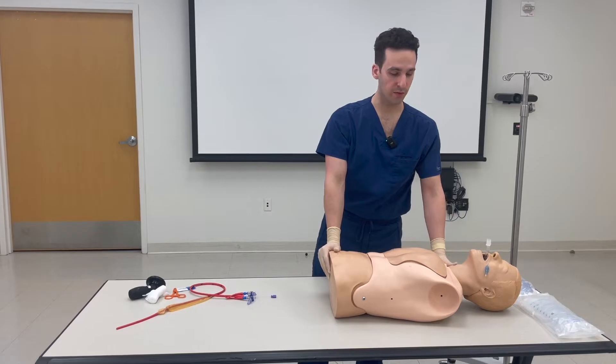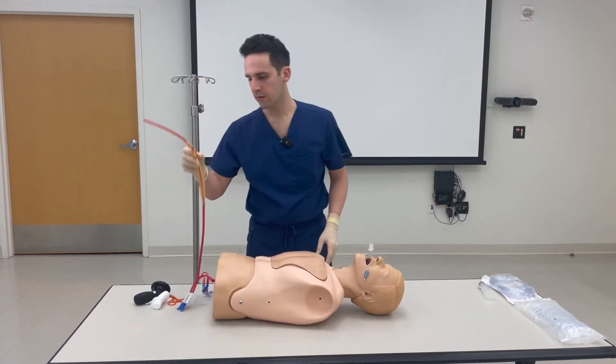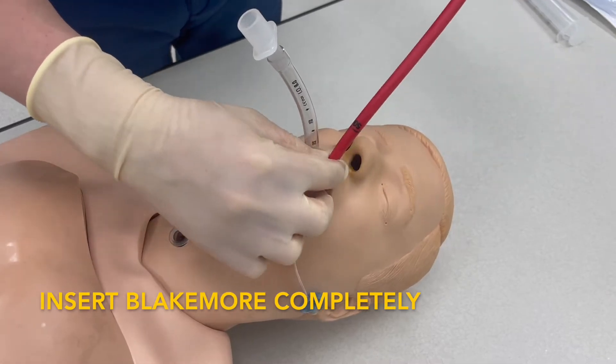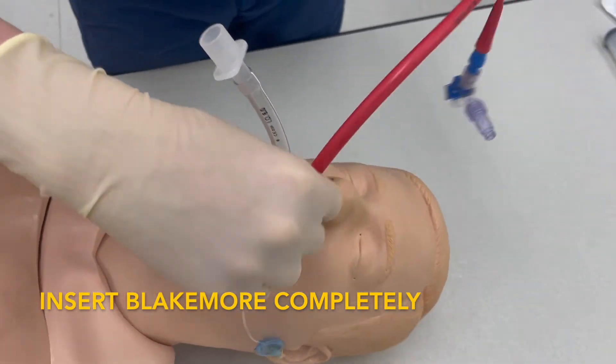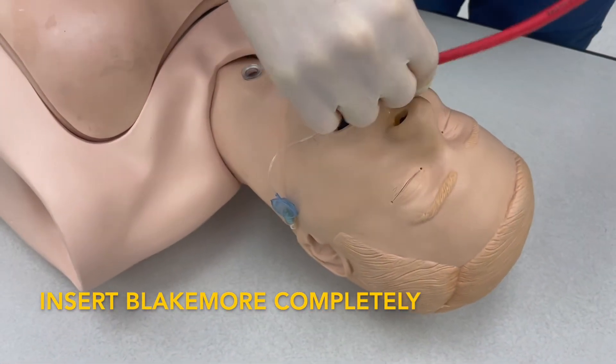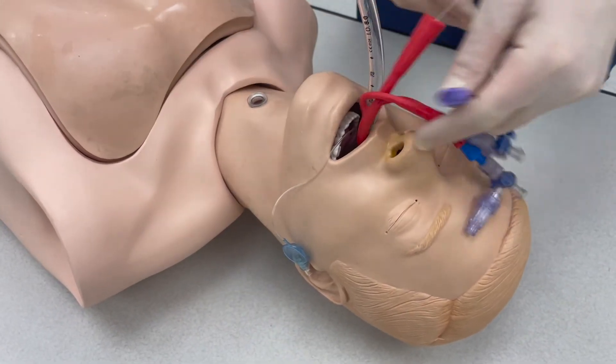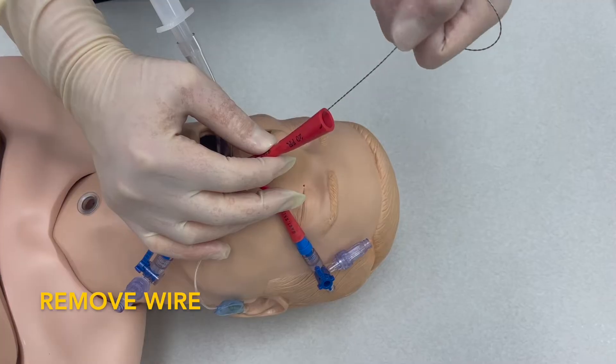We'll now focus on inserting the Blakemore. Take your lubricated Blakemore tube and insert it in the mouth entirely. You may now remove the Dobhof wire.